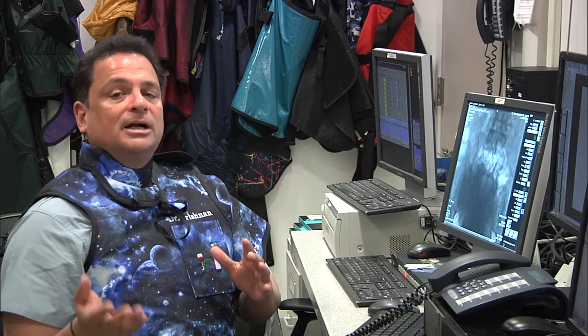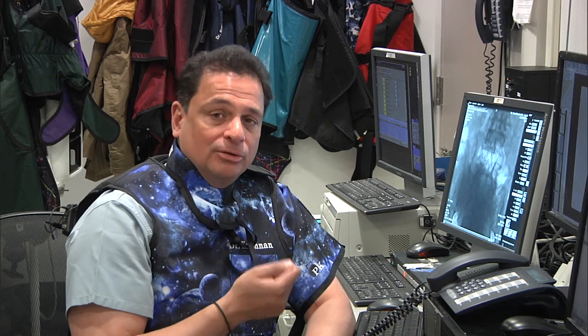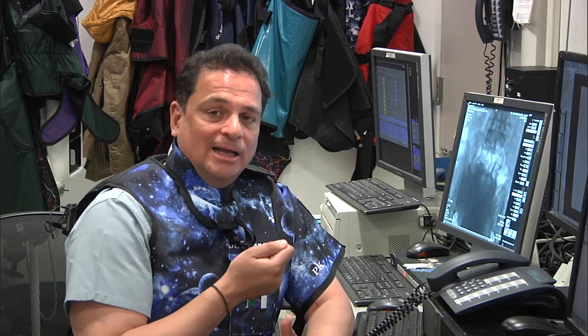So, you know, this is a very complicated case, and the real key to this, honestly, was the access, which was very difficult because we were going through a prior surgical site. Once we entered the prior surgical site, we were able to, again with great difficulty, dilate the track and then push a Terumo Fine Cross support catheter, as well as an 018 Trailblazer.